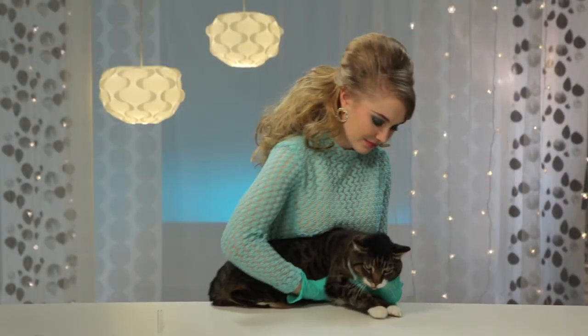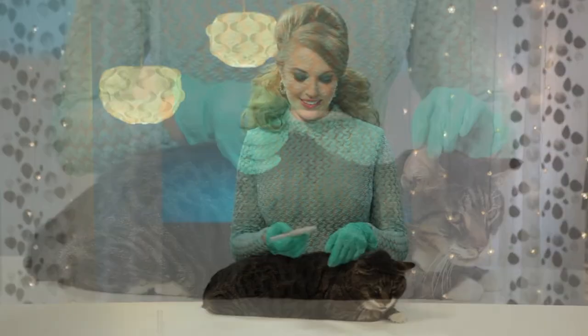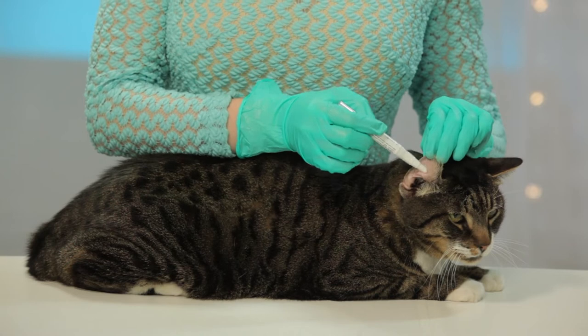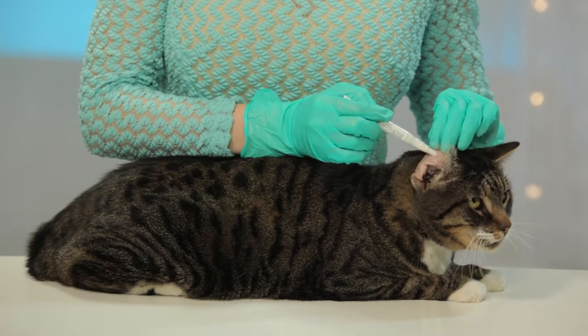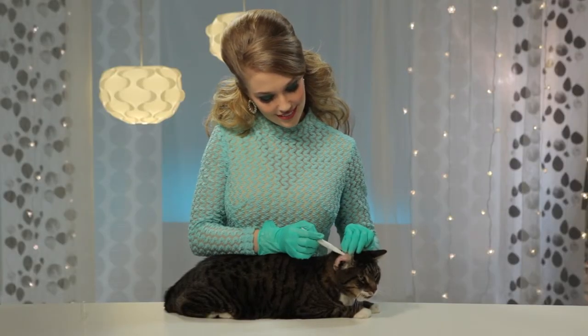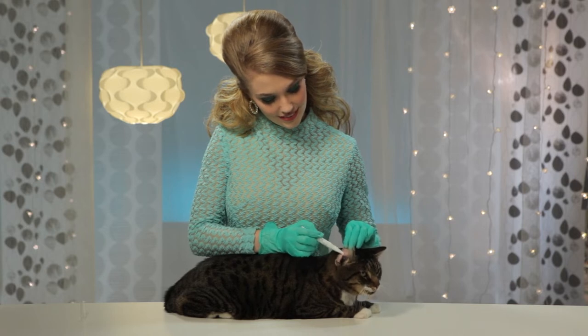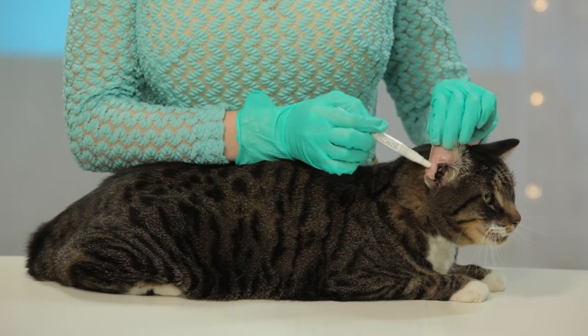Place the applicator tip directly on the inside portion of her ear flap — this is called the pinna. Now use the applicator tip to spread the medicine over the entire surface of the ear. Be sure to gently rub in the medicine well using the applicator tip.